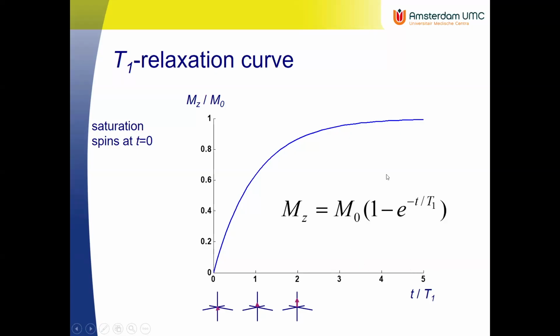And here again you see the relaxation goes exponentially, and there's the magical T1 value, the tissue property, which determines how fast the curve goes back to the equilibrium state. In this case, the equilibrium state is aligned with the field, so all the curves go back to 1, because 1 means that the z component of the magnetization is equal to M0, which is the equilibrium state.